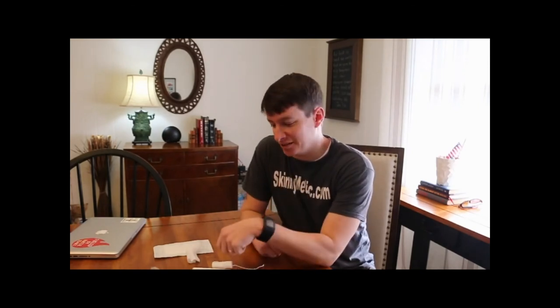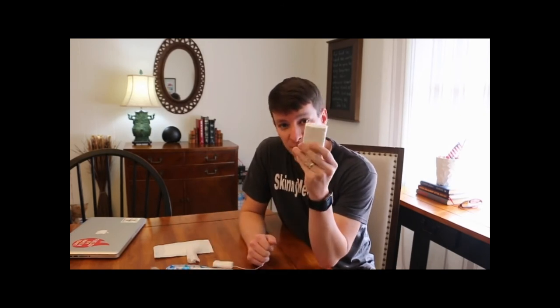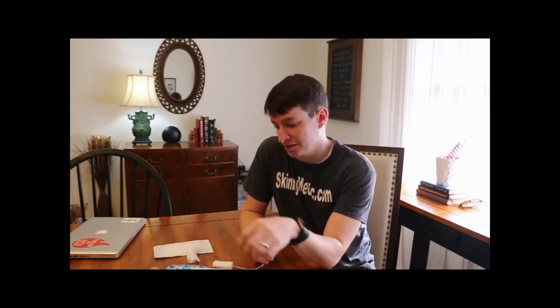There's a time and a place for that, but improvised medicine will kill patients. So when you get done watching this video, go out to your trauma kit, take this out of your trauma kit, put it in your bug out bag for your wife in case she needs it if you have to bug out. But take it out of your trauma kit, put some compressed gauze in there, put a roll of cling in there, but take this stupid thing out.